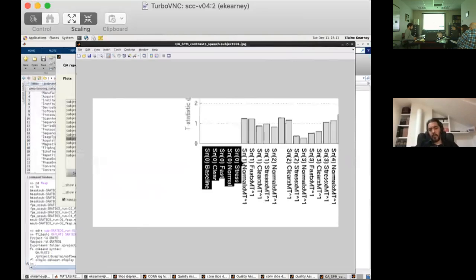Okay, you mean by, I mean, the problem is that by default, we don't want all of them to be session invariant because many of these are going to be like motion, like a correlation with motion, right? And that you want to be session specific, and others are going to be session effects. And those you also typically want to be session specific. So the scripts cannot make the assumption that when you say session invariant, you want all of the things to be session invariant. So you have to either guess it or provide it manually, which effects you actually want to model as session invariant.